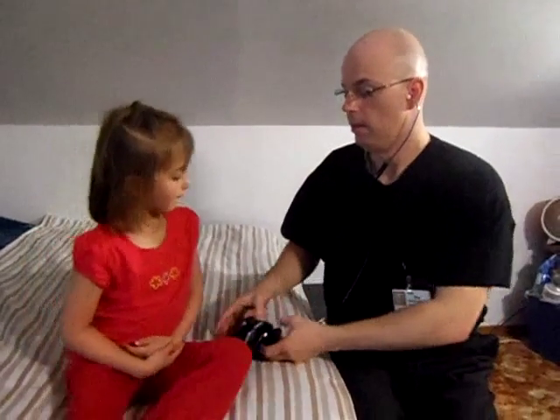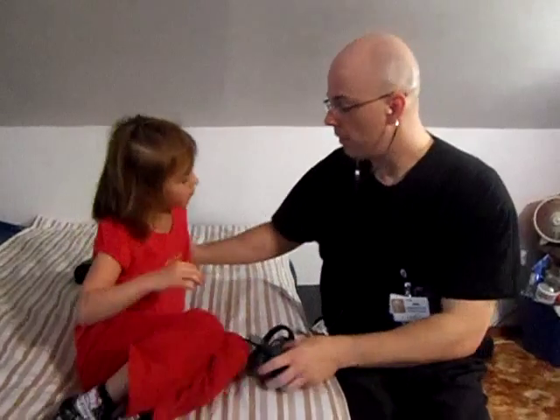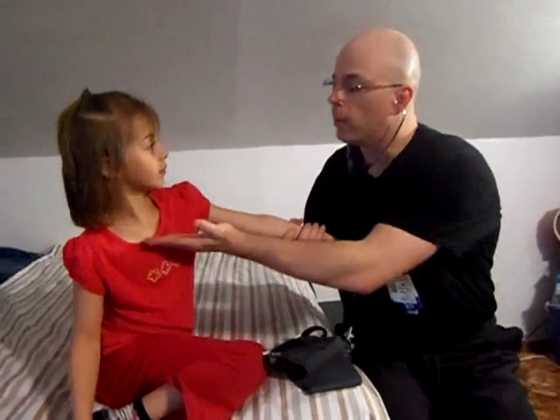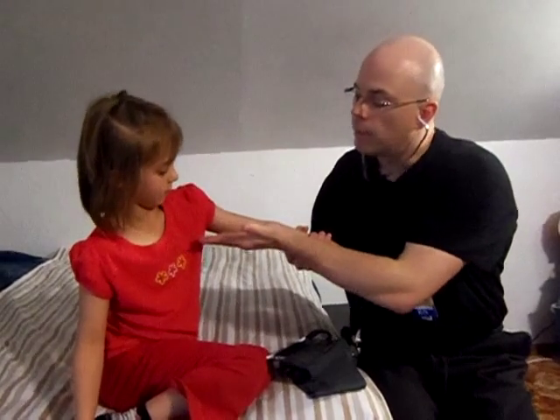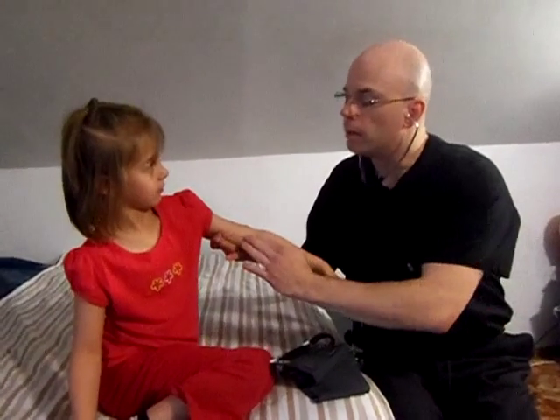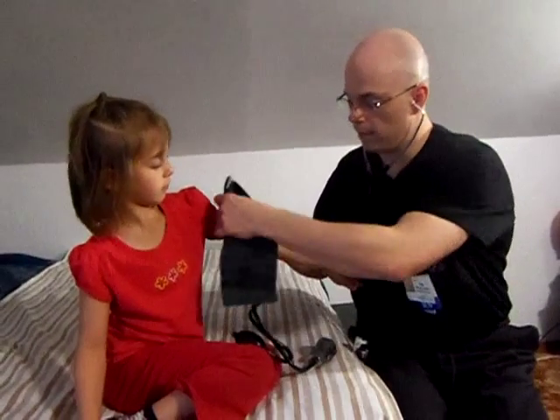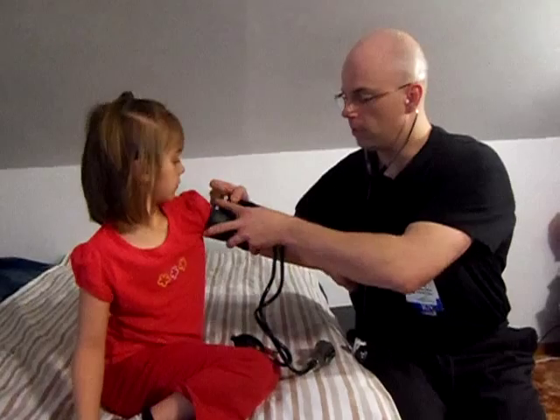The 2 instruments we use to record blood pressure are the sphygmomanometer, really fancy word for blood pressure cuff, and a stethoscope, what I call a heart listening to thingy. So this is Savannah's left arm, and we'll use that for today's exercise. We want her heart to be on the same level as her arm here. This is her brachial pulse. I'll feel for that. It's right there, right where we expect it. So we'll put this on her arm.